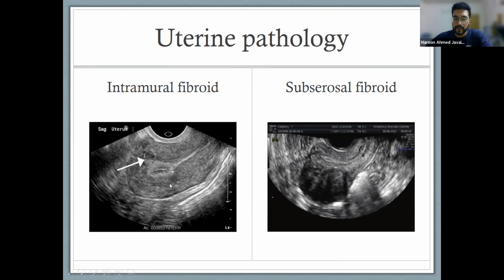So this is the muscle wall of the uterus, and they found a mass inside the muscle wall, so it's called intramural. This is subserosal. So remember how there's layers of each organ. So when you have the serosa or the adventitia, if the fibroid is over there, then we call it subserosal because it's right underneath this area, and it's causing this whole area to expand. So it is subserosal. So the serosa has spread out all over like this. Okay, so we know it's fibroid.